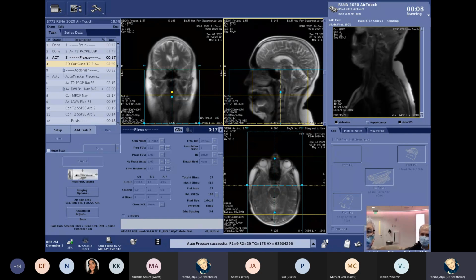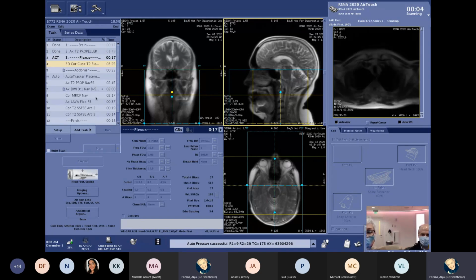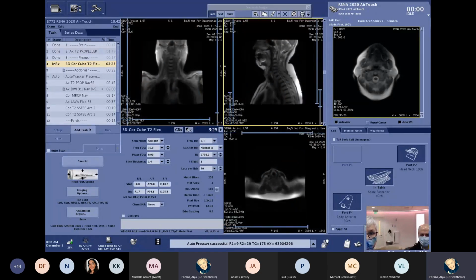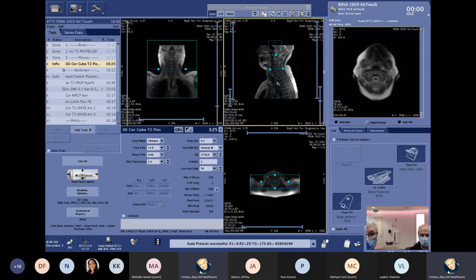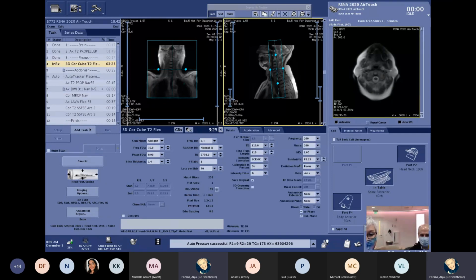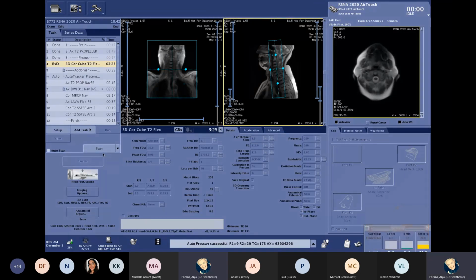So in the next scan, you will see that the system will understand that the air coil is already closed on his neck, and will pick accordingly, so that we can see the nerve roots going down to the humerus as well. So I go ahead and launch the next localizer. I will just prescribe the slices here. As I said, I use the HyperWorks acceleration technique. So HyperSense is picked with a factor of 1.2. And on top of HyperWorks, I selected HyperCube. That is done here with the excitation mode set to focus. That means in phase direction, I selected right-left phase encoding, so I do not have to worry about the shoulder wrapping, because I will read out only in the field of view here, and have only the excitation in that field of view. That ends me up with a scan time of 3 minutes and 25 seconds.